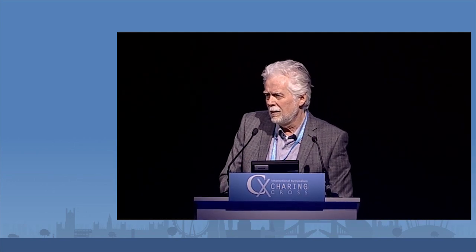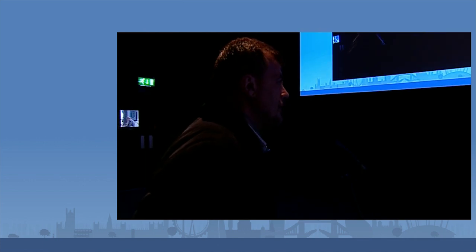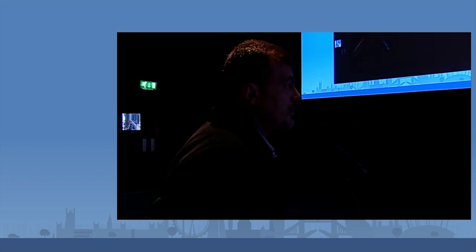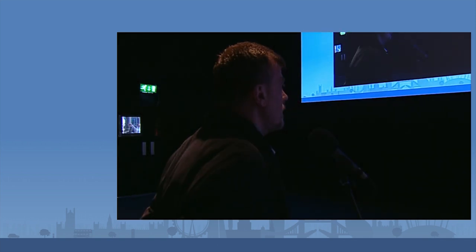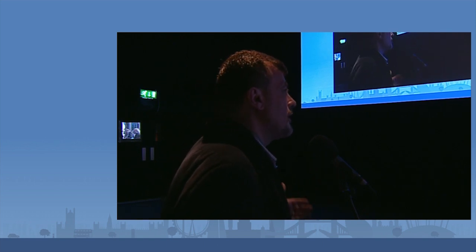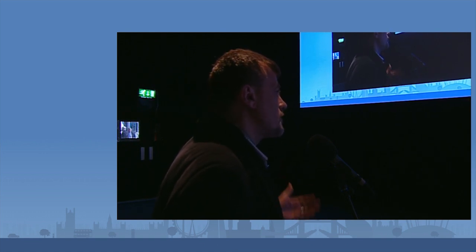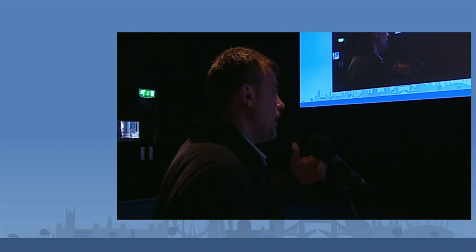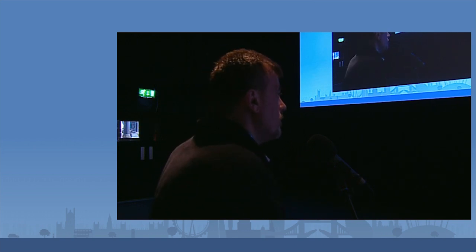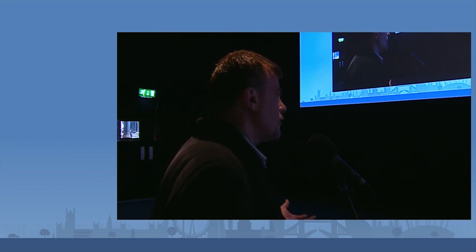I really admire the work. Is the software needed in the Angio suite? First, is it too expensive? Second, this perfusion angiogram: can we do it just before our intervention? I mean this pharmacological challenge perfusion angiogram, the one where you give tolazoline, an adrenergic blocker, and then you have your angio to see whether there's a change or not. If that could be prospective, this patient will get a value, especially if it's inflammatory, diffuse disease, to decide whether revascularization is of value or not.